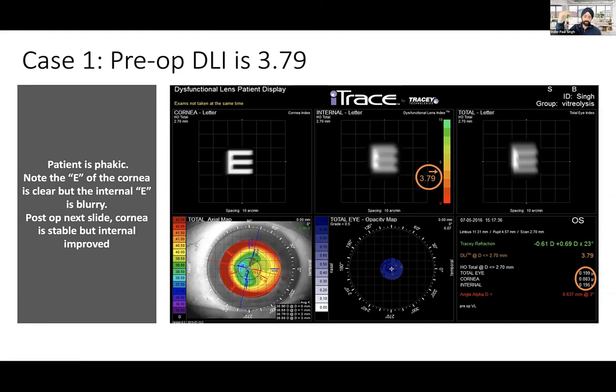Think of it that way. The higher the number, the better. Usually between 7 and above is considered pretty healthy. Between 4 and 7 is average, not that great. We're starting to get some decrease. Below 4 is considered very significant. That's kind of how I view it.